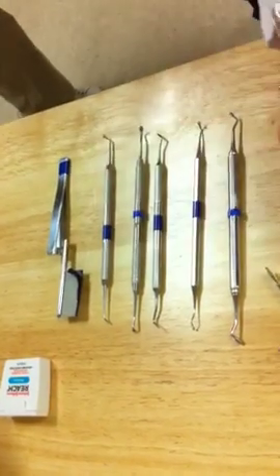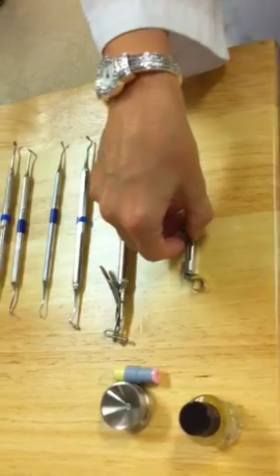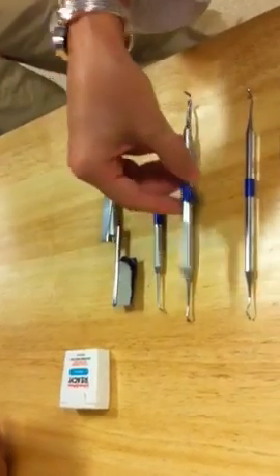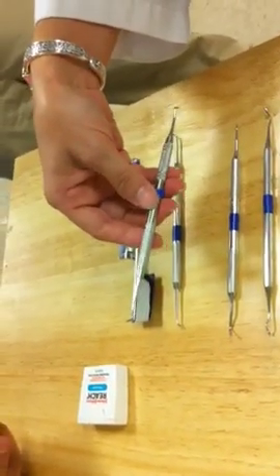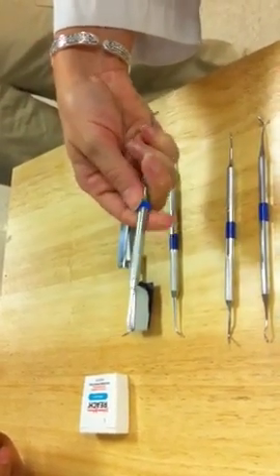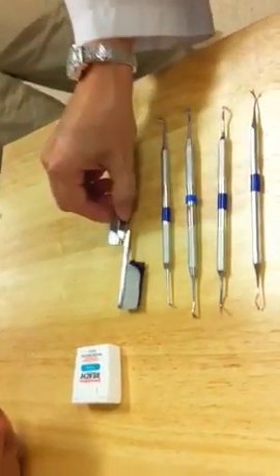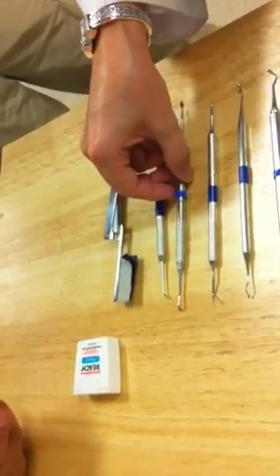Then you will be removing the matrix and Tofflemire and wedge if you've been using that. You'll use the Hollenbeck carver to carve the interproximal surfaces. And the cleoid discoid, or discoid cleoid, whatever you want to call it, to be carving the occlusal anatomy. Doctor will then check the bite to make sure that it's not too high. If it is too high, he'll go back with the discoid cleoid and adjust the filling.